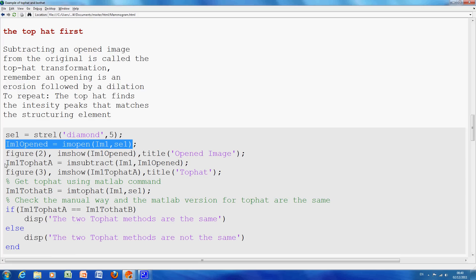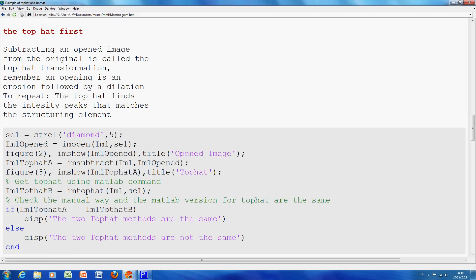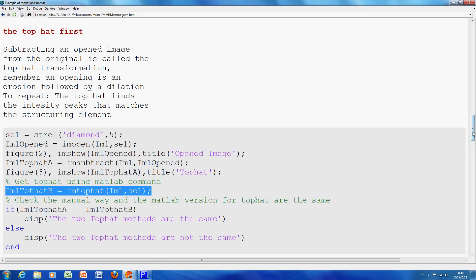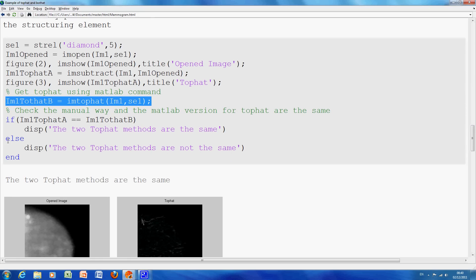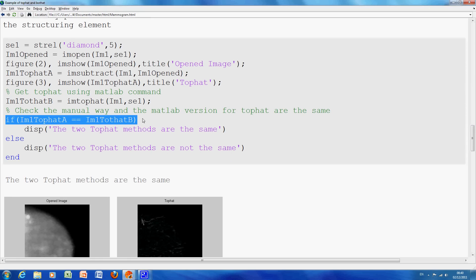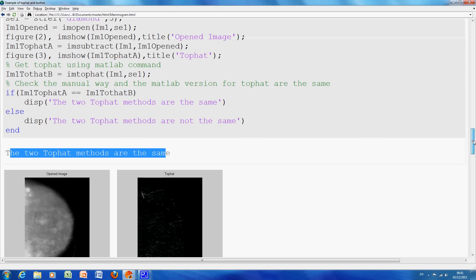There's the, as it were, by hand version of the TopHat. It's the original minus the opened. We'll look at it in a second. And then I used the MATLAB function here, IM TopHat. And I just wanted to test for equality. So, there we are. Does IM TopHat A equal IM TopHat B? It does.